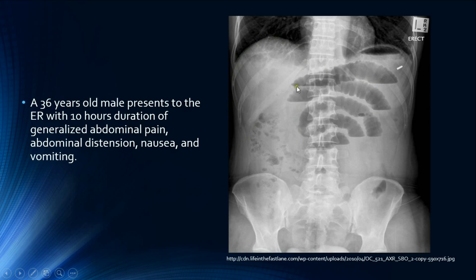The size of the solid organs of the abdomen looks normal, including the liver and the spleen. There are no obvious calcifications or stones in the gallbladder, kidneys, path of the ureters, or urinary bladder. There are no obvious skeletal abnormalities. I cannot see any foreign bodies such as drains, lines, or clips. This tiny radiopaque object is probably an artifact. In summary, this patient is suffering from small bowel obstruction.